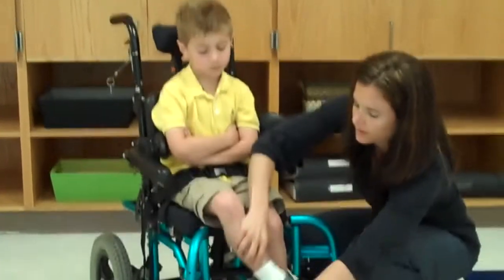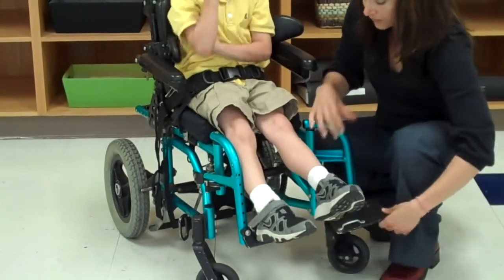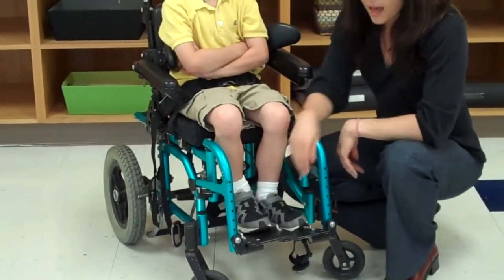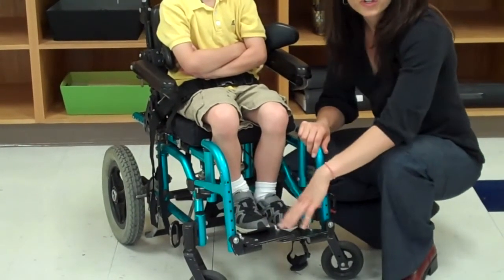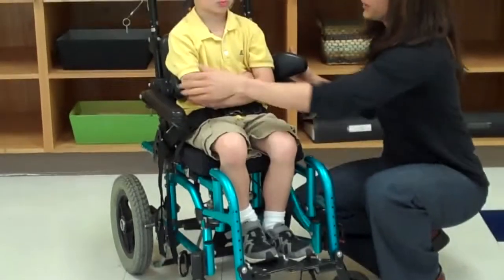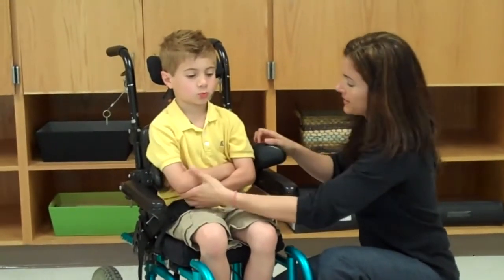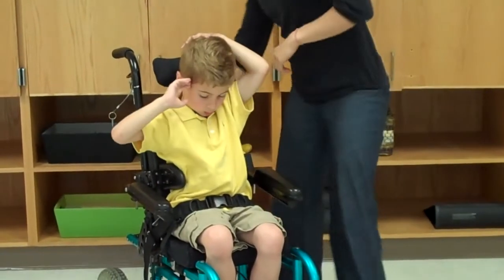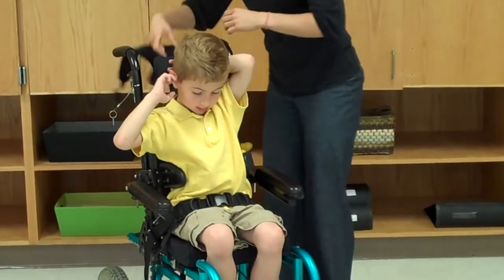We're going to flip the footrest back into place to give him a nice firm support surface. At this point, if there were any heel loops, you would want to secure those at this time. From here, we're going to flip the laterals in. And now we'll adjust and secure his anterior chest support.